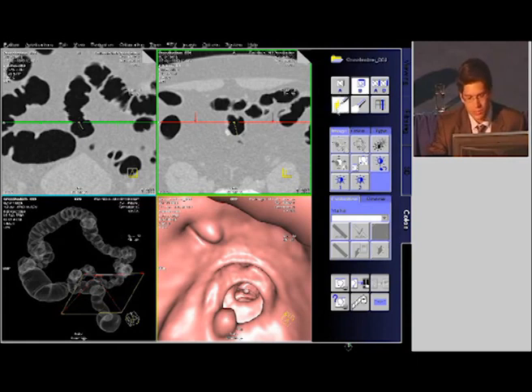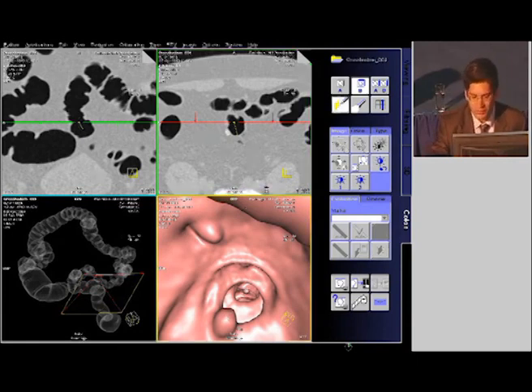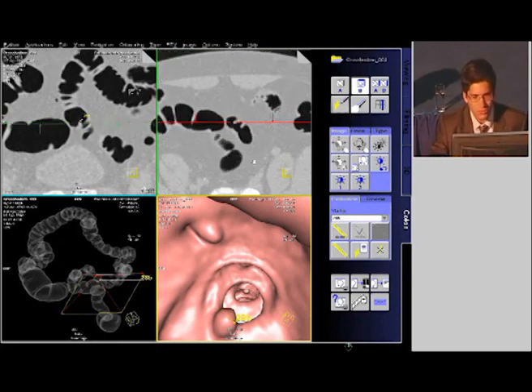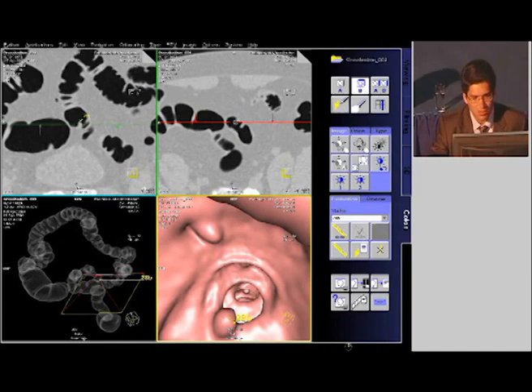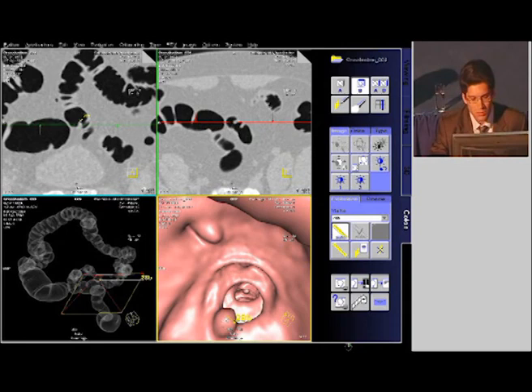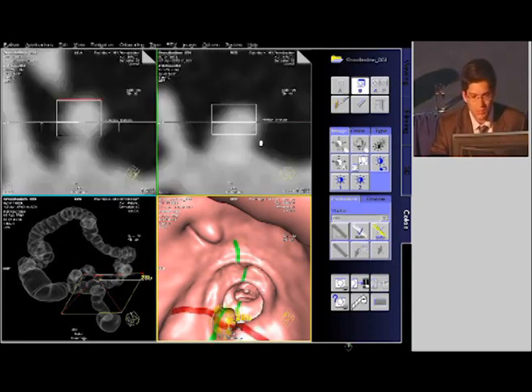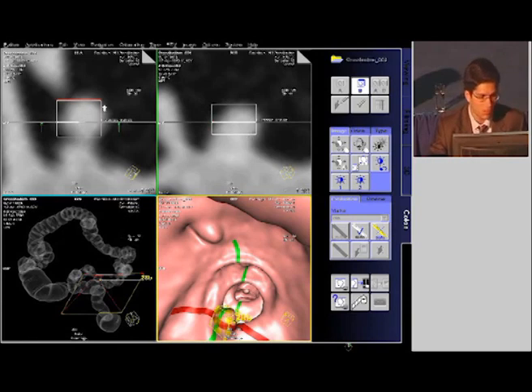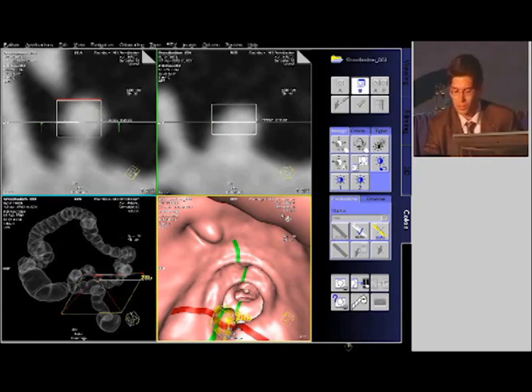And then again, we have this polyp here. It's the same process again — just put a marker on it, it's going to show up here, and you can quickly scroll back and forth and see that this is indeed a polyp with a little stalk to it. Same in the coronal plane. Just an automatic measurement, quickly getting the exact size of the polyp, and it's going to be nicely magnified here. This is a very good approximation of the size of that polyp.